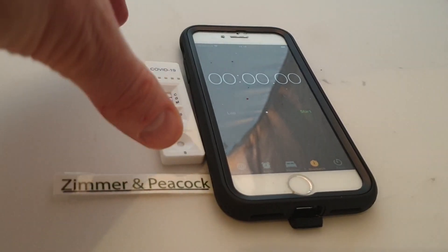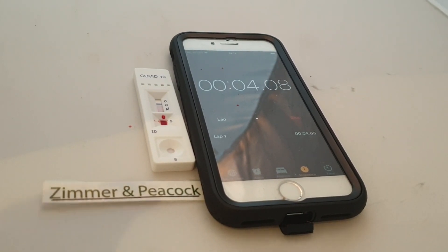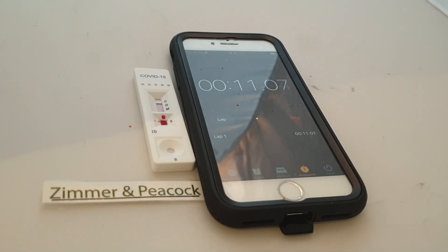If I just tilt it slightly towards you — I'm going to start the watch as well, because I want to have a look at this after two minutes. You can see, if you watch this video back, that there's a pinkiness that comes up, which is basically my blood being drawn up and going up the strip. The last one at the end is actually the control — the C stands for control, it's a kind of quality control to make sure the device is actually working correctly.